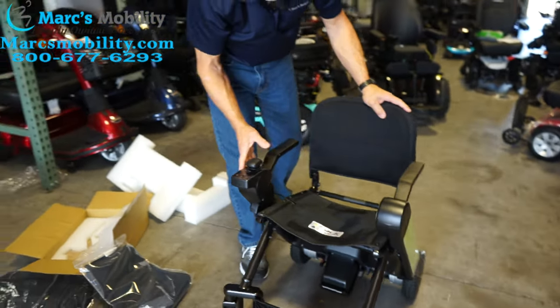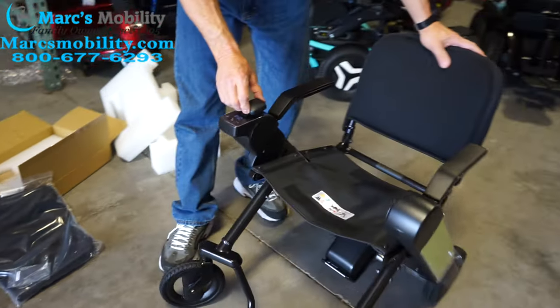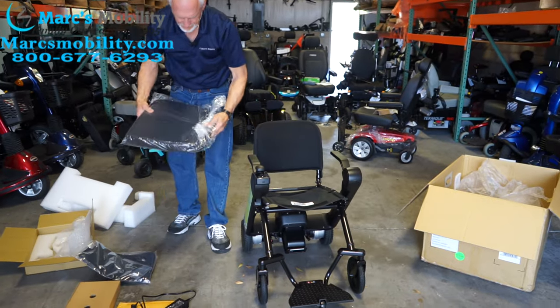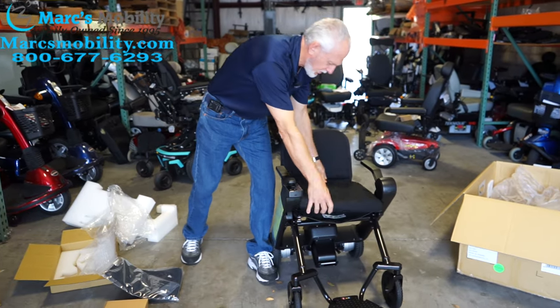So now we've got power. You can see the chair moves now. Now we'll take the bottom cushion and put that on our seat.